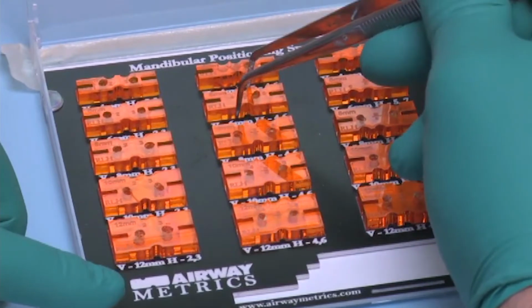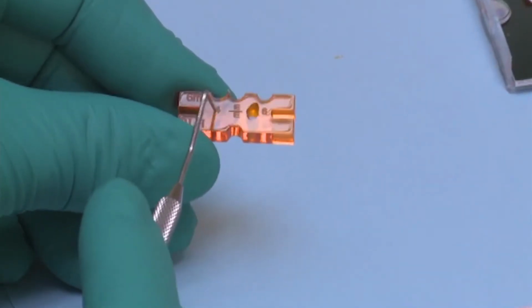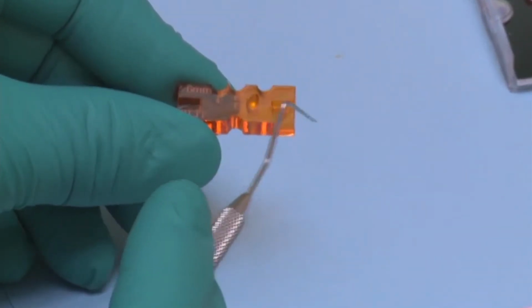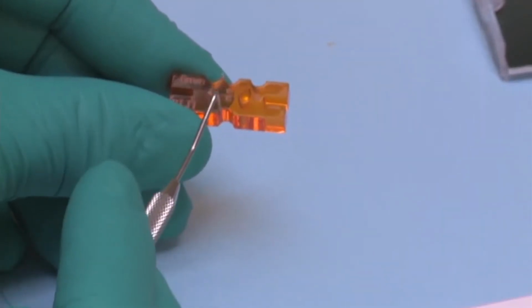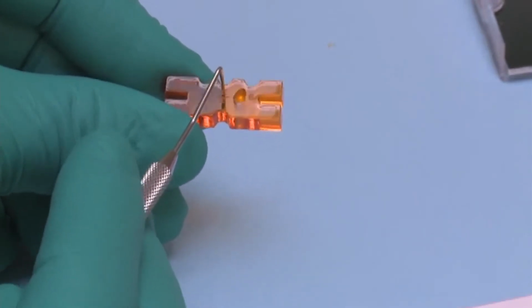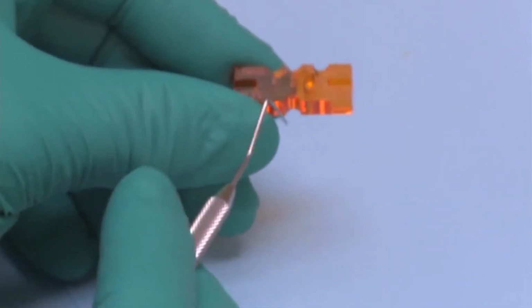So here is 6 millimeters vertical, and this is edge to edge, edge to edge. This would be 4 millimeters of protrusive or horizontal and 6 millimeters. So remember, I always like to start with less is more, meaning edge to edge. So let's see how Kim responds at 6 millimeters of vertical in an edge to edge position. We will position this notch over her maxillary incisors and have her close into the single notch with her mandibular incisors and see what type of response we get.